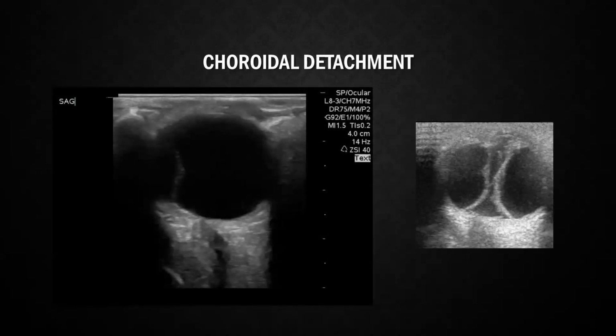So choroidal detachments, basically you get blood or fluid between the choroid and the sclera. So going back to our previous anatomy, on that first slide of this section, you can see how that would cause a detachment. And basically, if there's blood, it tends to be a little bit more painful than if it's just fluid. Low pressure in the eye can cause this. So if someone just had some sort of surgery or a procedure for glaucoma, they may be more prone to this. In addition, being on anticoagulation is a risk factor. And again, being older is a risk factor too.